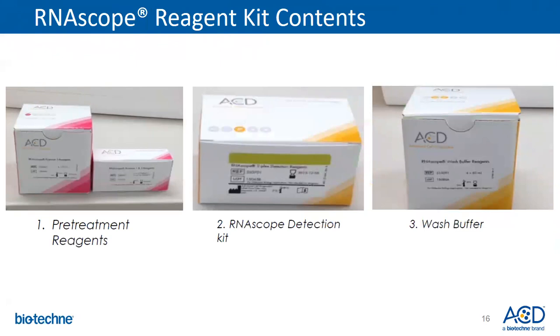The detection kit has your amplifier reagents that you need to be able to visualize your signal. The chromogen as well. If you're doing the fluorescent assay, the V2 assay, you would need to, again, get the TSA or opal dyes from Perkin-Elmer. And then wash buffer. We have a fair amount of wash steps in there that make sure that you don't have background issues. And that comes at a 50x concentrate. A quick tip, if you ever see precipitate in your wash buffer, just warm it up to 40 degrees. The precipitate should go right back into solution.